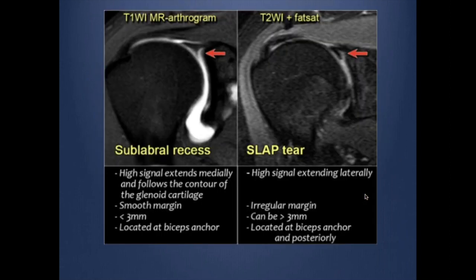The superior and superior-anterior labrum is a common area of variant. We have the sub-labral recess and we have the labral foramina at this region. So generally, how do we differentiate between a real tear and the sub-labral recess? There are some criteria. The sub-labral recess usually extends medially, while the tear extends laterally. The recess has a smooth margin, while the tear has a more irregular margin.